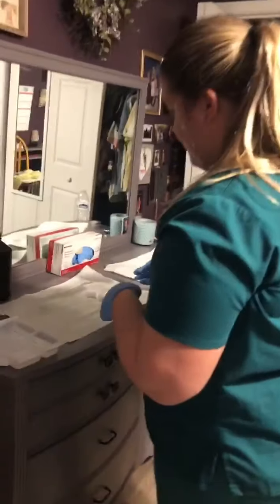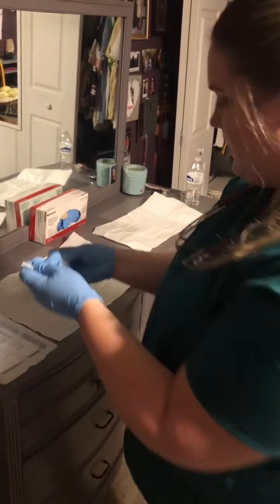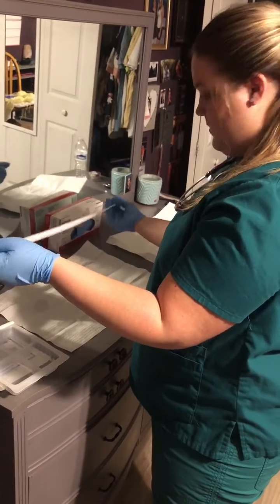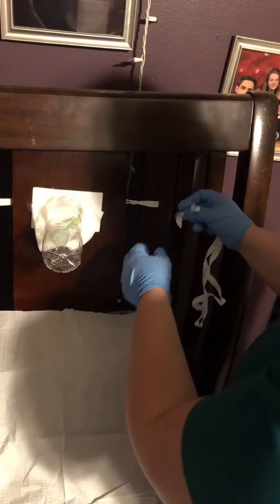So lastly, I'm going to put new trach ties on. When you put the new trach ties on, you don't want to remove the old ones first. You want to start with putting these ones on.